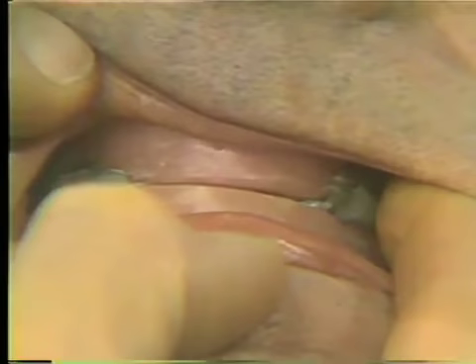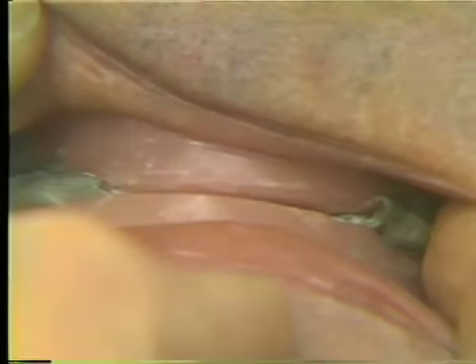All right, we'll place maxillary in and the mandibular rim. And now, Mr. Monahan, just slowly close, but shove your jaw slowly forward, right about there. Now close a little more, a little more. Okay, stop right there. Now note that we did not allow him to come completely close to the correct occlusal vertical dimension. We're keeping him a bit open. And now open.